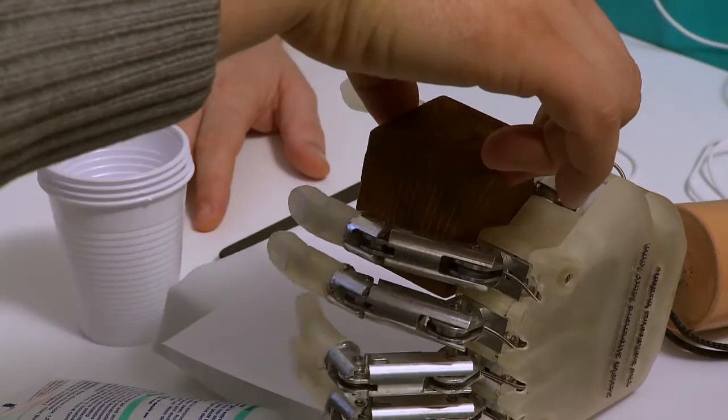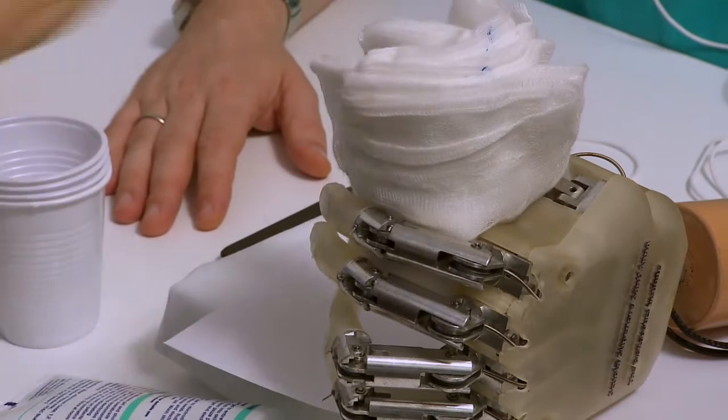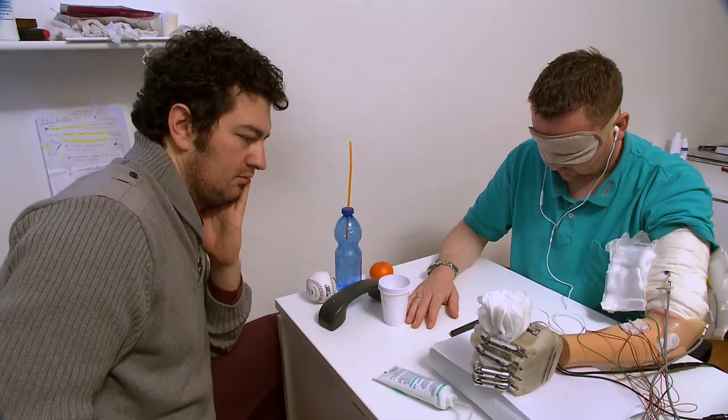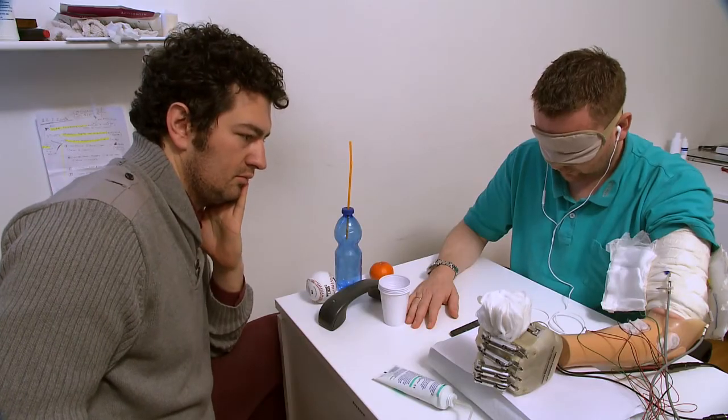You can feel round things and hard things and soft things. The feedback was totally new to me and suddenly when I was doing some movements, I could feel actually what I was doing instead of looking what I was doing. I would love to have the new prosthesis because it is so amazing to feel something that you haven't been able to feel for so many years.